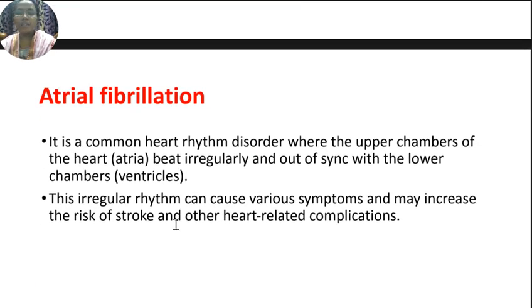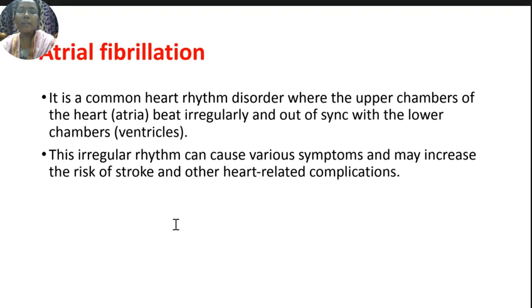Again, the fibrillation, atrial fibrillation. We already discussed what fibrillation is. If the asynchronous heart rhythm occurs at the upper chambers of the heart, then it is called atrial fibrillation, right? The irregular rhythm can cause various symptoms, and it may increase heart failure, the effect of stroke and other heart related complications.